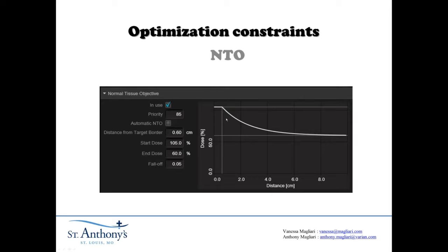We used NTO, but not with a very big priority — only 85. It's 0.6 centimeters from the target, starting at 105% and ending at 60%, with a fall-off of 0.05 — not very strong, because we don't want to be too restrictive. If there's any plan you're going to use the NTO the least on, it's these breast plans, because they're by definition not uniformly conformal. You want to really spread out the dose into the lateral side of the patient and have a very sharp gradient along the chest wall. So in cases like this, you just don't put much priority on the NTO — these are very non-aggressive numbers.